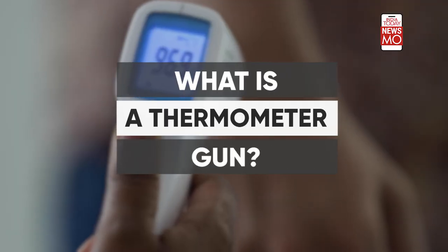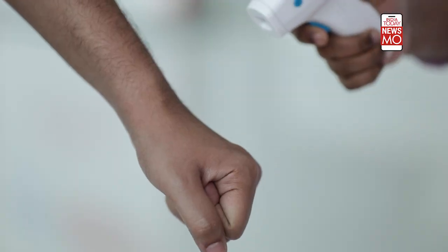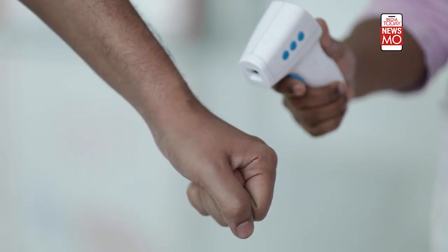How does it work exactly, and how accurate is it? We're going to tell you what this thermal gun is all about. Body temperature is a very clear-cut giveaway sign for COVID symptoms — it's the first thing you would want to check while interacting with anybody coming from outside. This gun comes in handy because it reads your temperature very quickly and it can note your temperature without any physical contact with the subject.